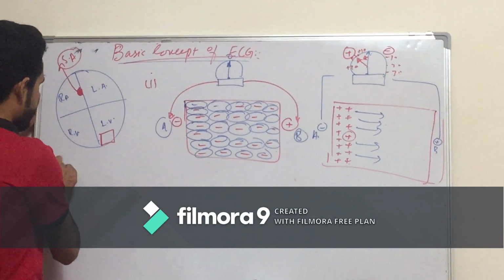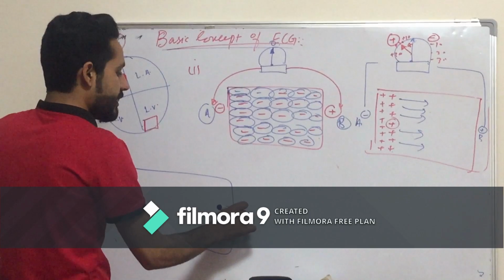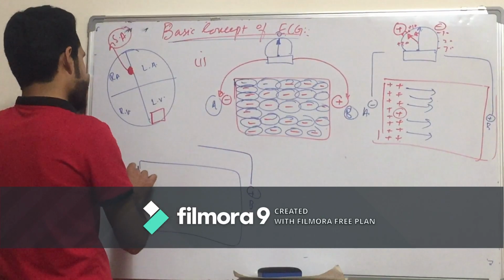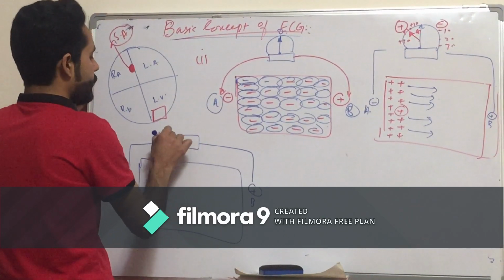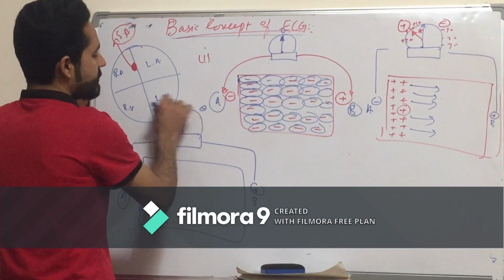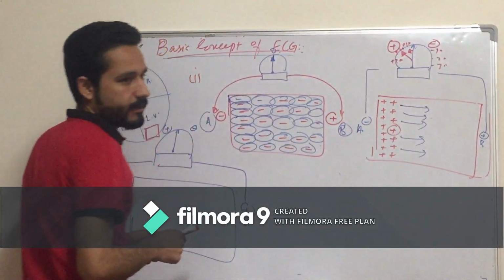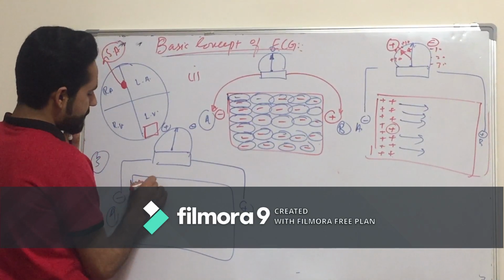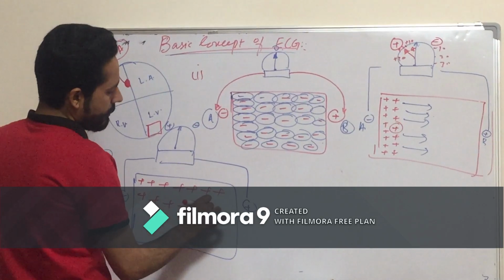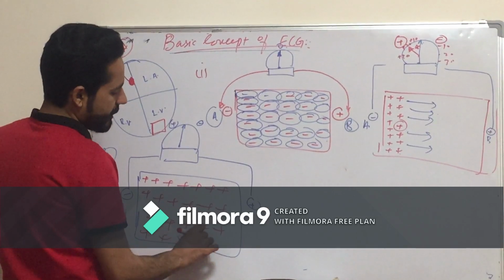Third observation is, suppose the same myocardial cell, this is B in, positive in, and this is A in, negative in, and both are connected as usual into the galvanometer. This is the needle of the galvanometer, this is the positive side and this is the negative side. Now the depolarization advances, and after some time all the myocardium is depolarized. All the myocardium becomes depolarized, or we can say all the myocardium is filled by the positive charge.